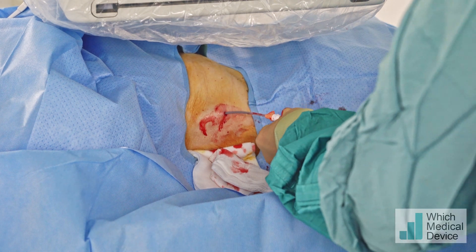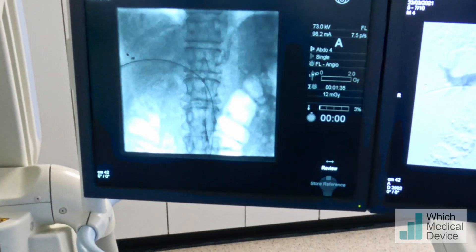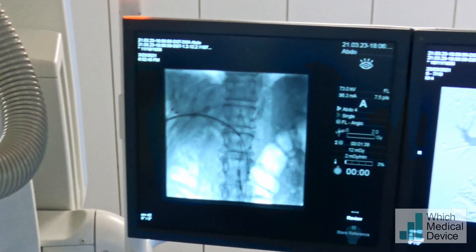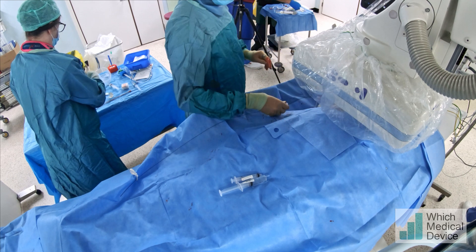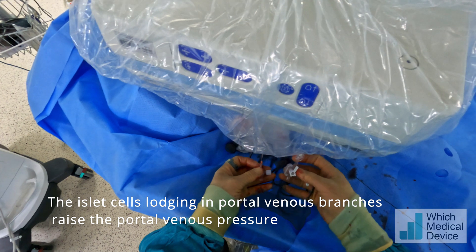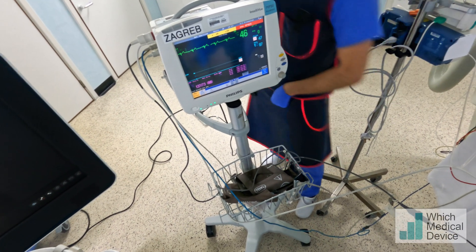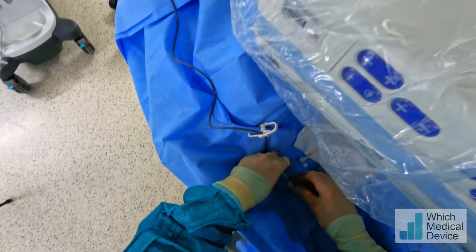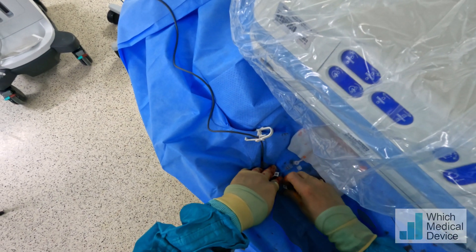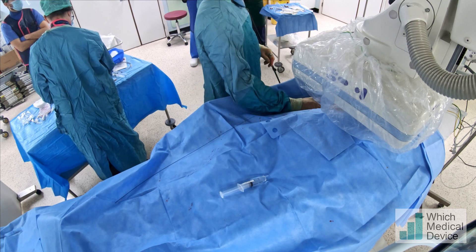We're just going to reconfirm our position with contrast and then we're ready for the islet cell infusion. So in the main portal vein, what we'll need to do is measure the portal venous pressures before we infuse the islet cells. We've now zeroed our CVP pressure, which is measuring the portal venous pressure. We're now going to open this to the patient — it was zeroed to air — and we're getting a pressure of 14. So portal venous pressure prior to the infusion is 14 millimetres of mercury.